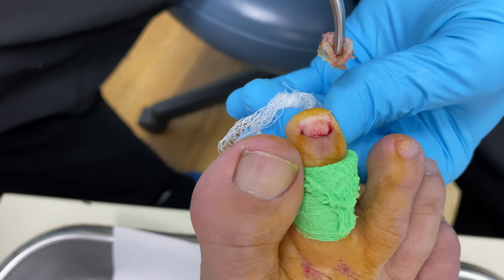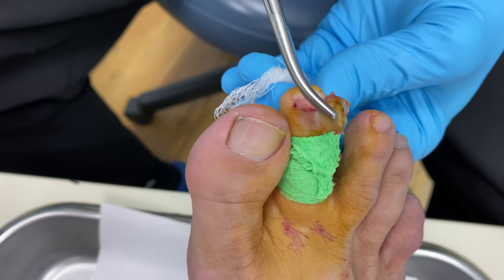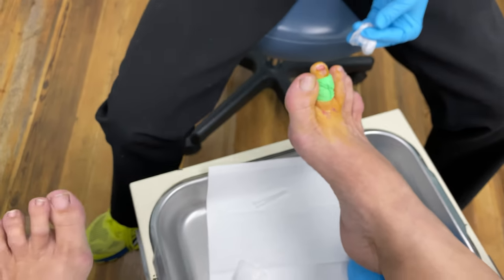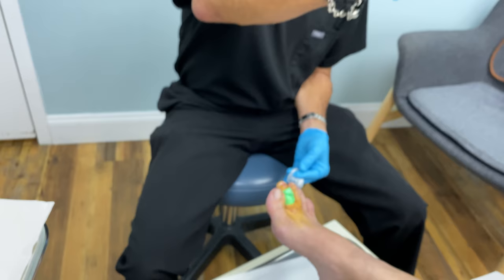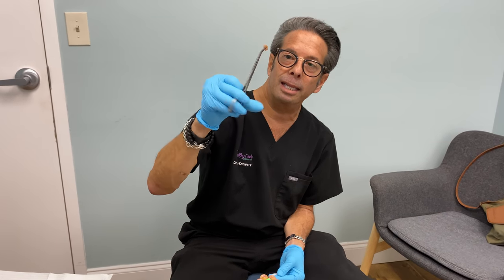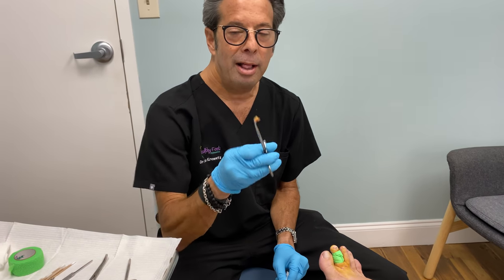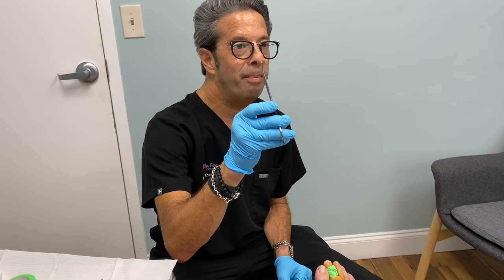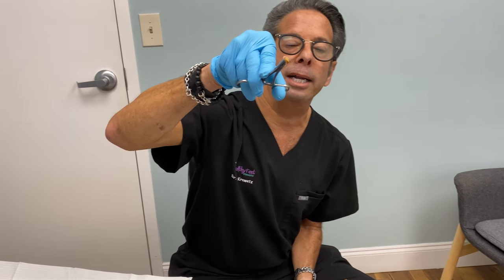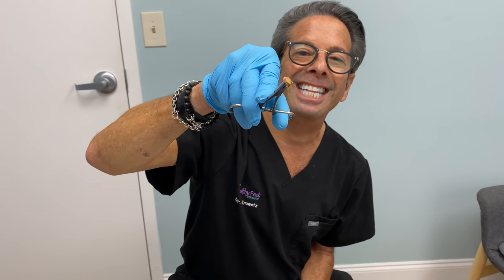So let's pull this off — and you can see this comes off really easily. That's it. That's the whole nail right there. Nice big chunk. Let me show the patient. And then when it's far away it looks smaller, doesn't it? Not that big. But this is great — she's going to get a ton of relief. This little guy was causing a lot of pain. And you can see just from the thickness of it — is it as big as my teeth? It is.